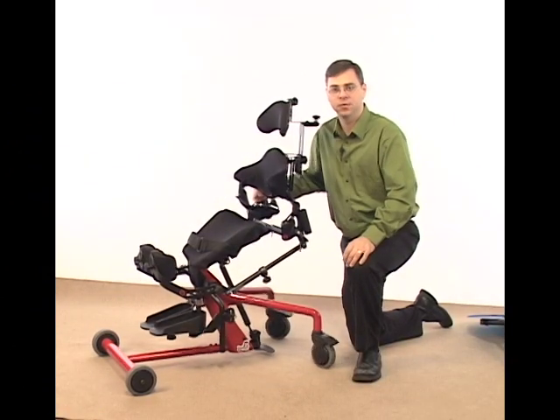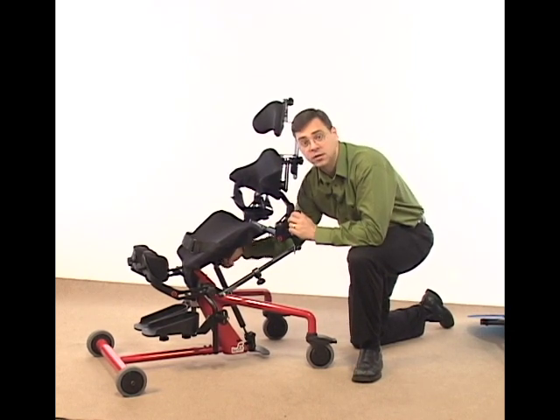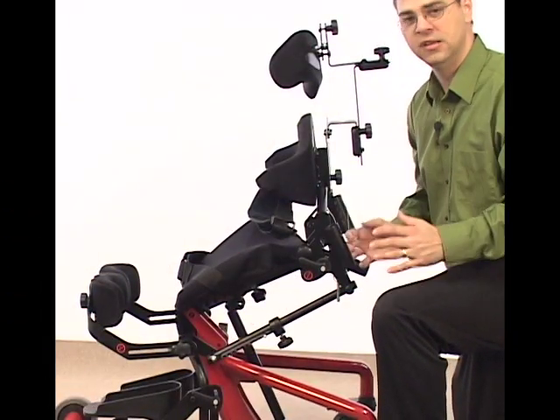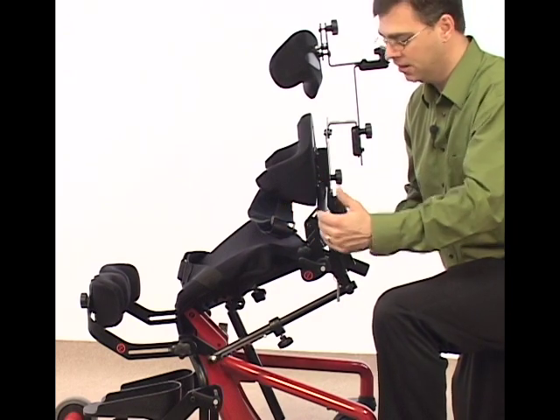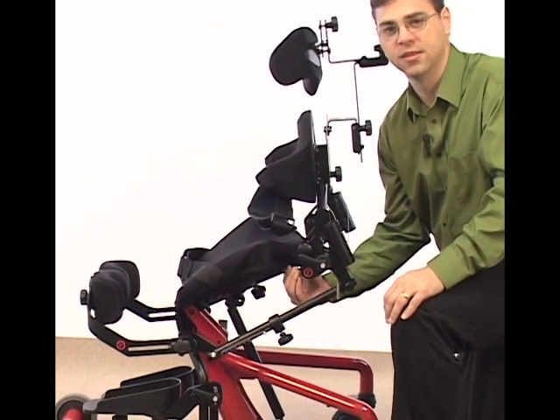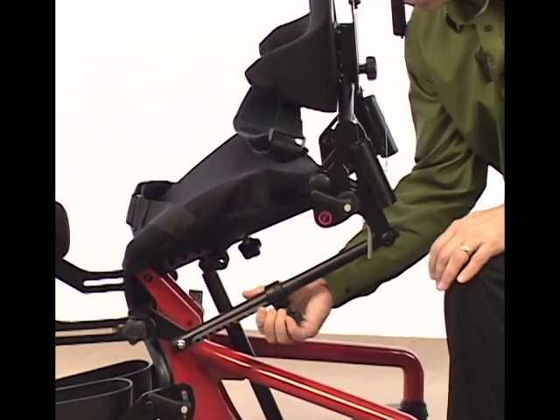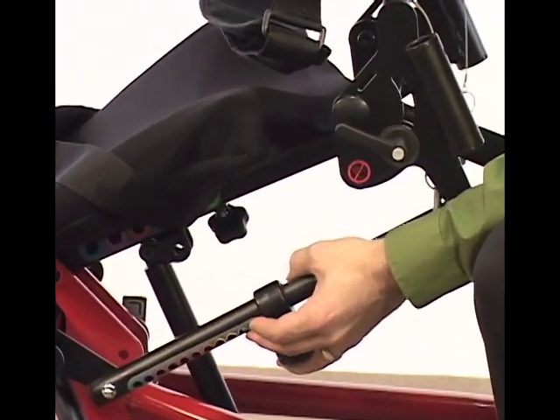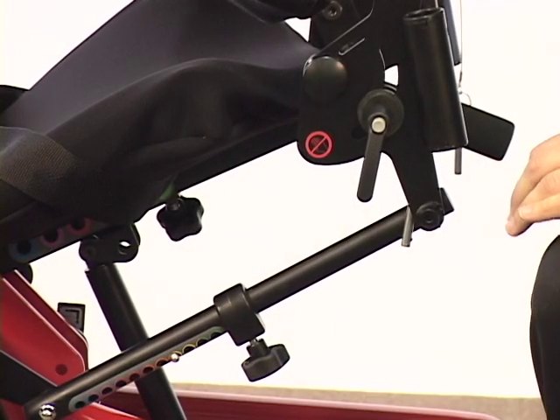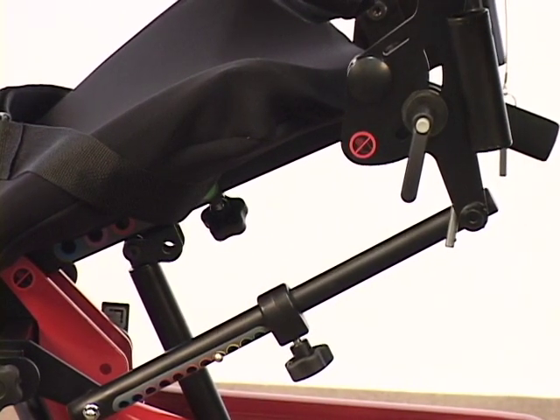Before we adjust the seat depth, we need to loosen the knobs on the following arm and on the seat tube, located underneath the unit. If we want to adjust the seat depth closer in for a small child, we want to adjust the small bar first. I have the seat depth set all the way back in the furthest seat depth position — you know that by looking at the button on the following arm. I depress the button and loosen my knob on the side. When making this adjustment, I only want to go a few holes at a time, because it helps contain better leverage on making the whole adjustment.